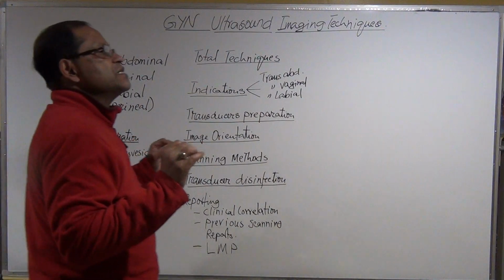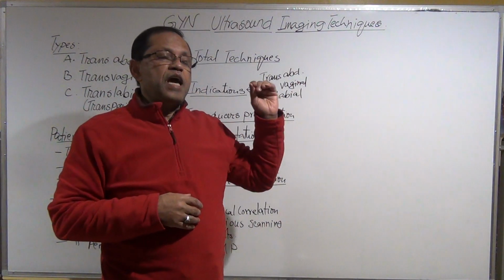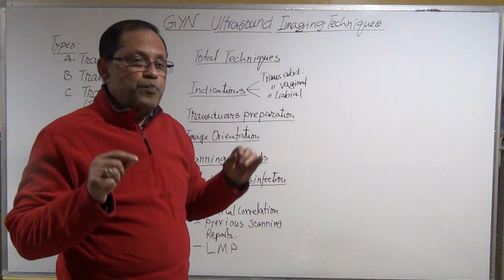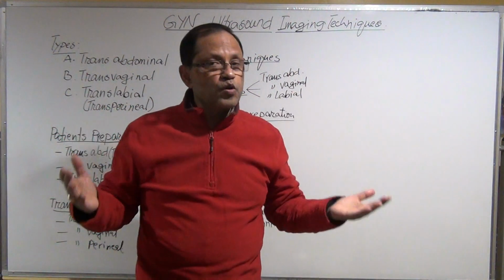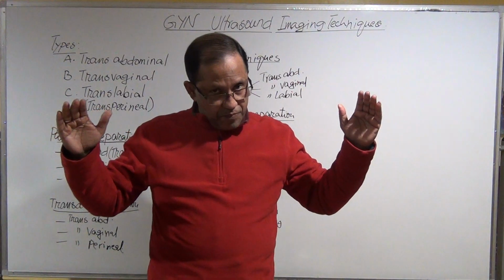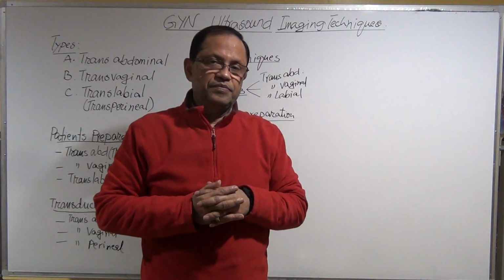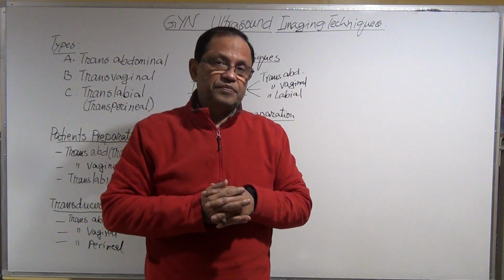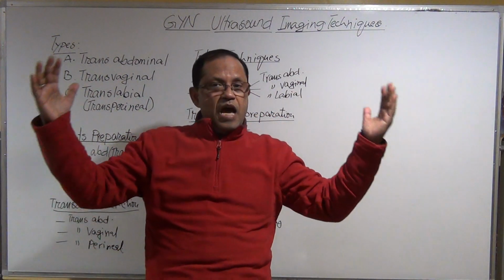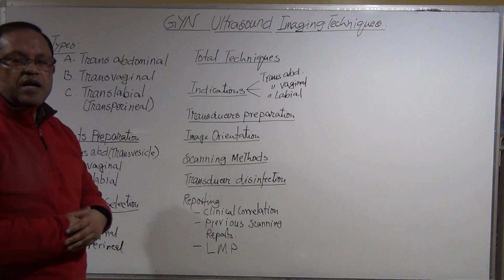So when a registered sonographer with a good machine and transducer does the appropriate type of protocol and approach onto the different person, especially considering the age group, pregnancy status, and the signs and symptoms, when all those are considered, then we pick which type of examination will be done.